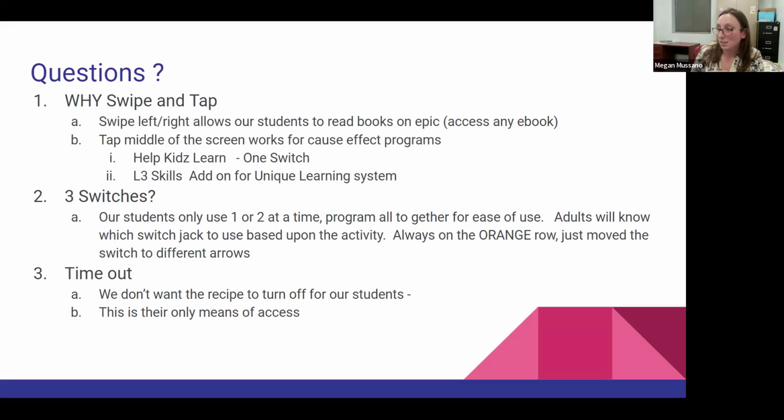One question was, yes, it will work on an iPad Pro. It's just the USB-C connector. All the links I gave you were for the regular Lightning adapters, but the same things were true and worked with the USB-C. I did have the single camera app with the USB-C for the Don Johnston, and I bought the 3-prong with the USB-C connection for the Hitch 2. And these did work with my iPad Pro. So I tried them, I promise.